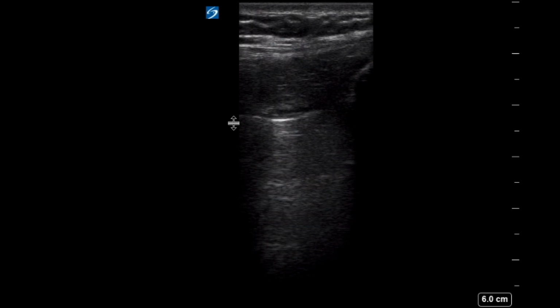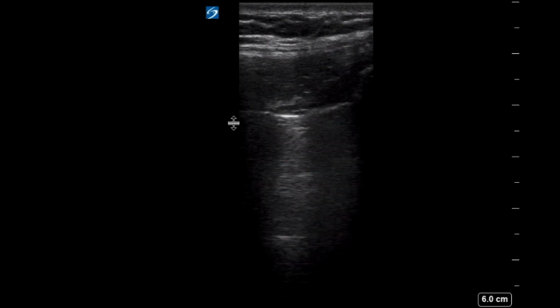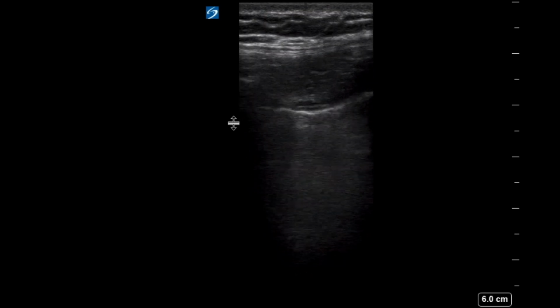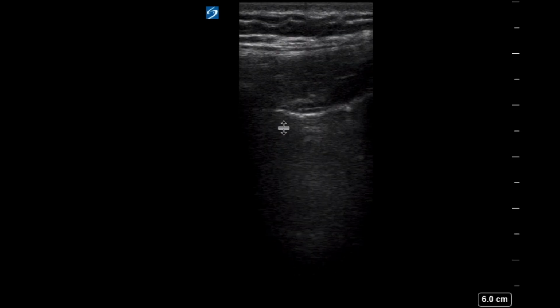And then to show a good example of appropriate lung sliding, this is a different rib space where the lung is still adhered to the chest wall, because this was not a complete, 100% pneumothorax. This is an example of normal, good lung sliding through here with the breath.